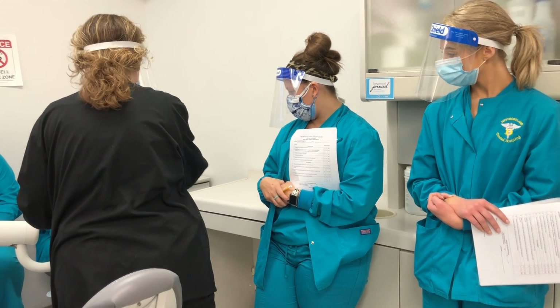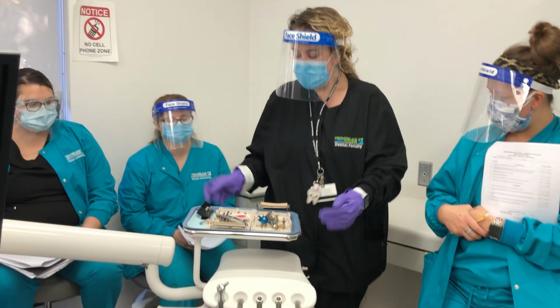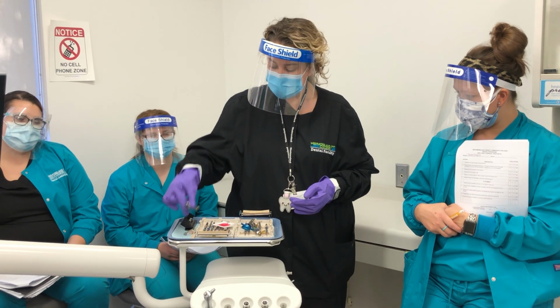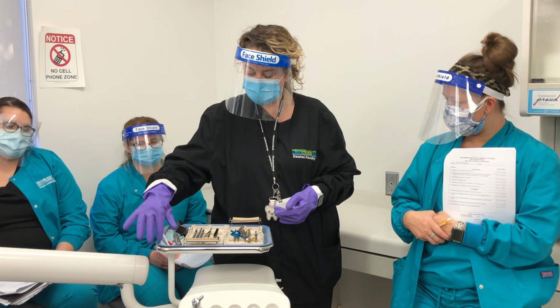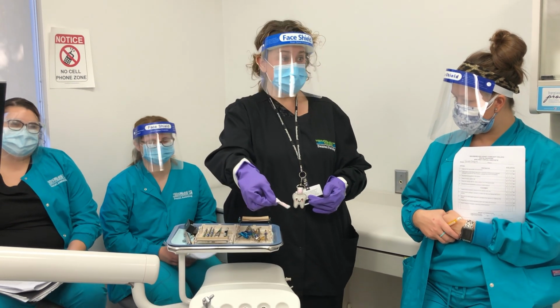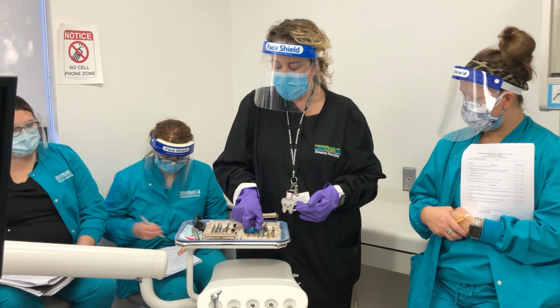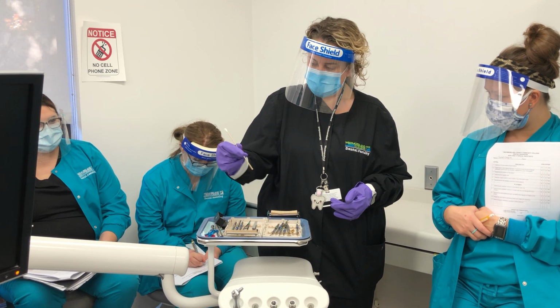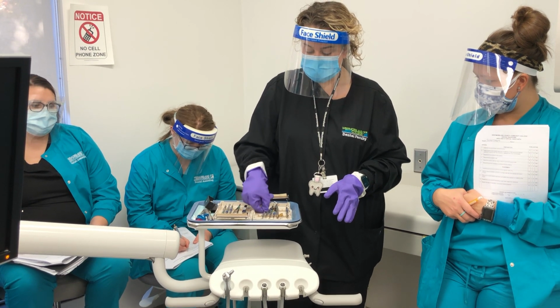So what you're gonna do, and I'm gonna wiggle around here so everybody can see me from the back, is organize your tray before you walk with it. Things like the handpiece, you're gonna move over to the side. Things like your biohazard, you're gonna move that over to the side. Can everybody see our fake blood? This is marker, but in the event that it was patient care, it would be real blood. Then we're gonna move our anesthesia carpule, or syringe, over, and our little throwaways over, and then really all we have is our base instrument cassette.